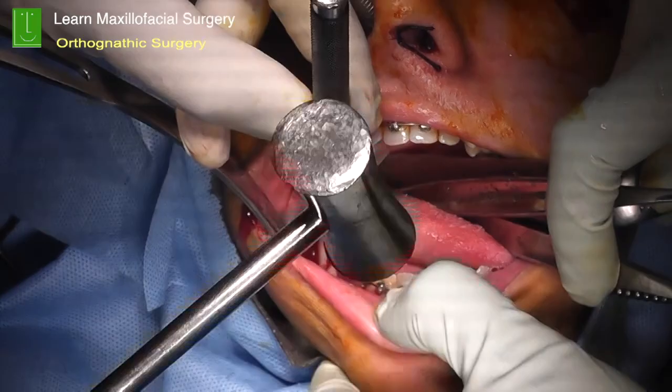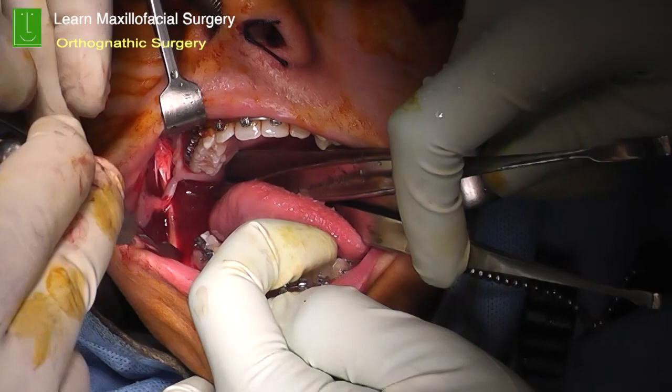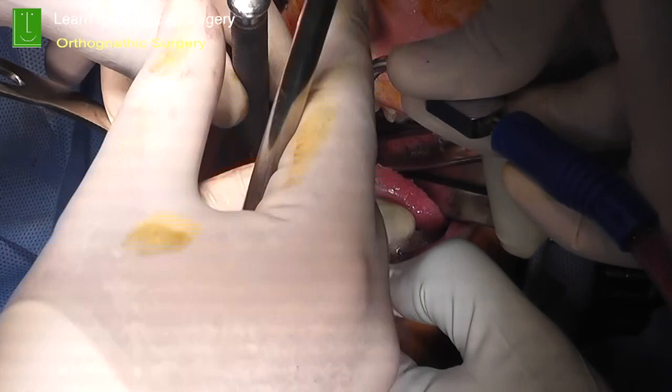Once the cut has been completed, then you can use a fine osteotome. Different widths and sizes of osteotomes can be used, but the key is to use it very, very gently so that you basically spring the bone rather than splitting it. So the nerve is the crux of the whole surgery.